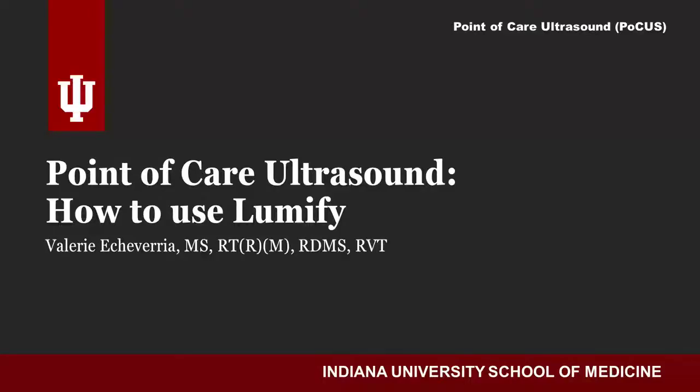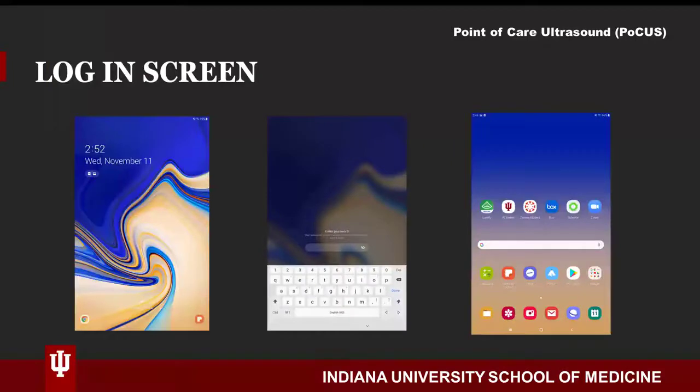In this point-of-care ultrasound session, I will detail the features and functions of the Lumify device. To begin, be sure that the sector probe is connected to the tablet. Once you open the cover, you will use your finger or the stylus to activate the passcode page.